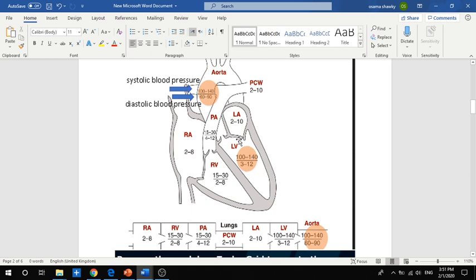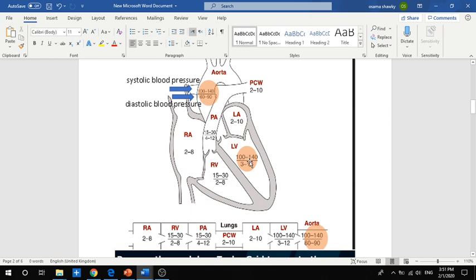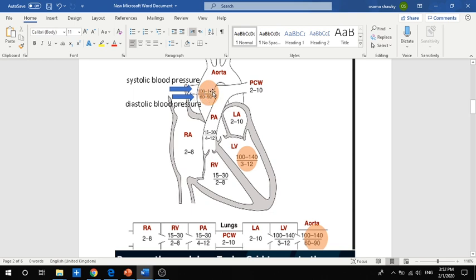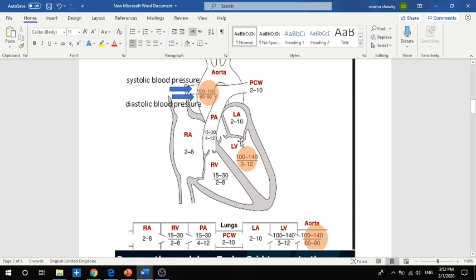When we're talking about engineering, we talk about flow rate and pressure. Pressure here is 100 to 140 mmHg systolic blood pressure and diastolic blood pressure which is 3 to 12. At the outlet port, we have 100 to 140 and 60 to 90. We have to select the design point, which is at the maximum head and maximum flow rate.